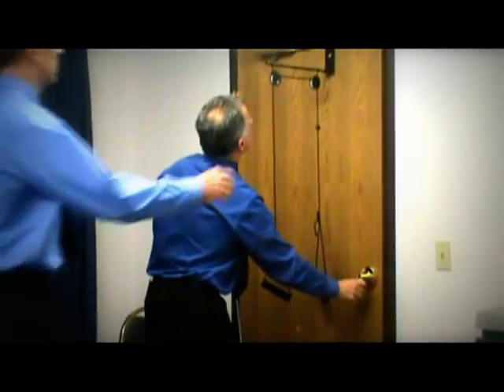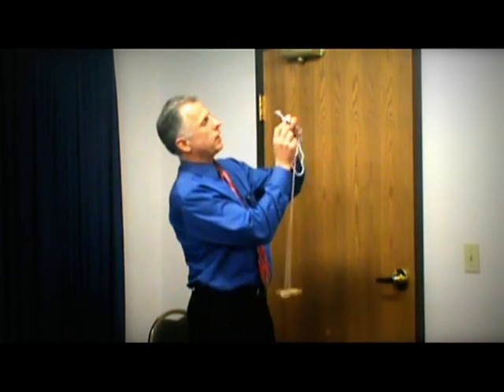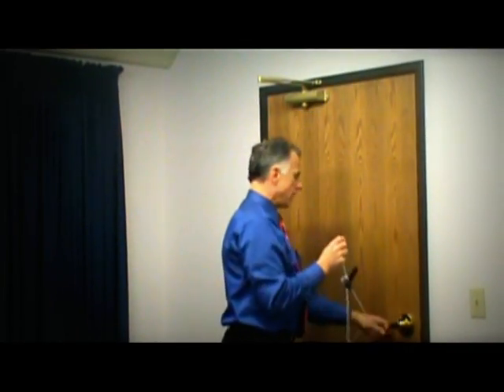Here, I've got this, Bob, so we can give them a better idea how a finished product looks. So you got your little pulley you bought down there at Menards, and you got your little knot and the rope tie.